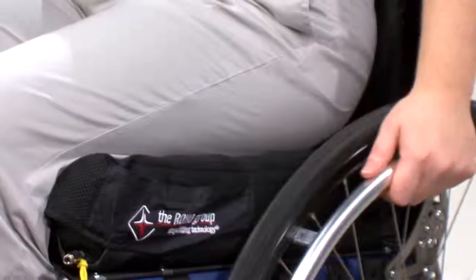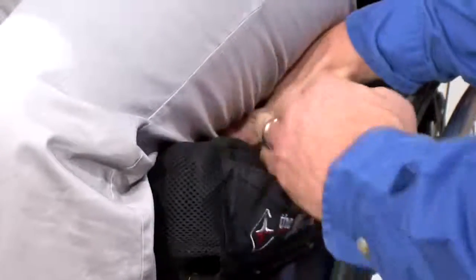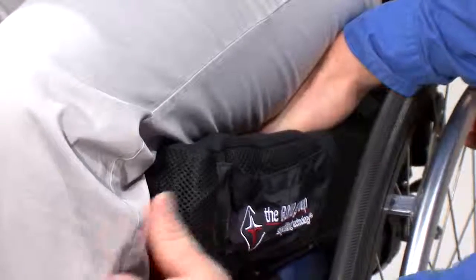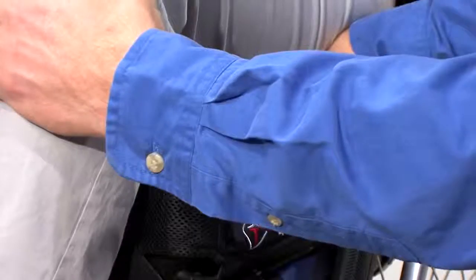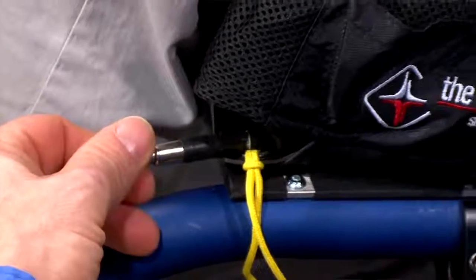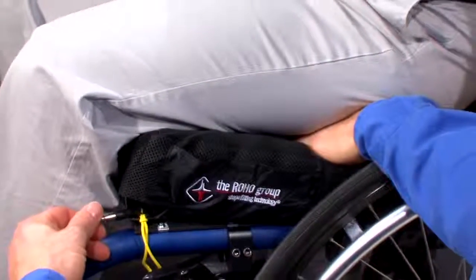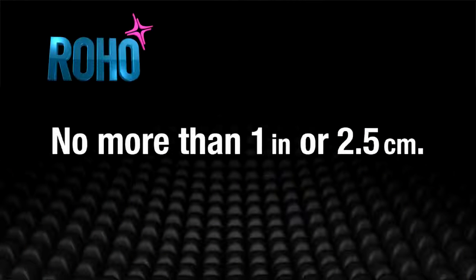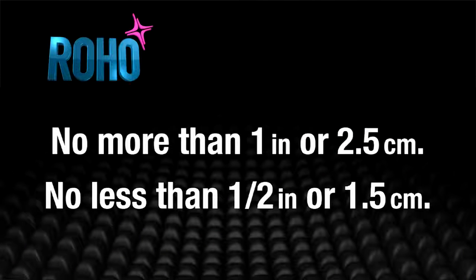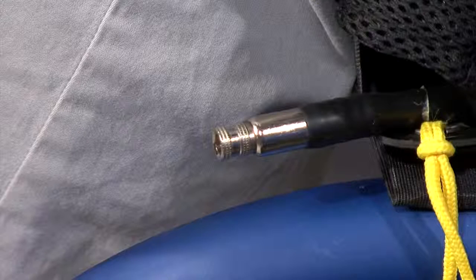Repeat steps one through three for the remaining air valves on multi-valve cushions. After over-inflating the cushion, have the individual sit in the wheelchair. Make sure the cushion is centered underneath and the individual is in their normal sitting position. Now take your hand and slide it between the cushion surface and the individual's bottom. Lift their legs slightly and feel for their lowest bony prominence. Then lower their leg, reassuming a normal sitting position. Once this is achieved, turn the air valve counterclockwise to let out air while keeping your hand under the individual's lowest bony prominence. Slowly release the air until you can barely move your fingertips — no more than one inch, 2.5 centimeters, and no less than a half an inch. Once the correct distance has been achieved, turn the air valve clockwise to close the valve and stop the release of air.